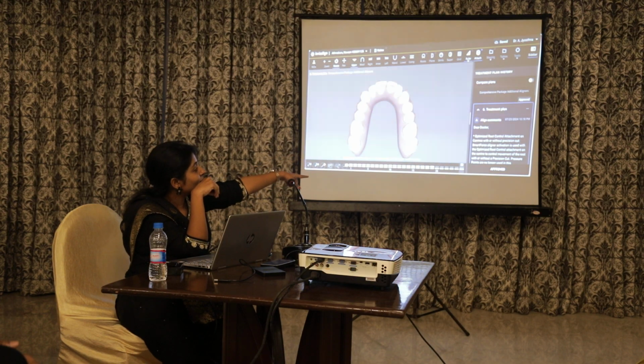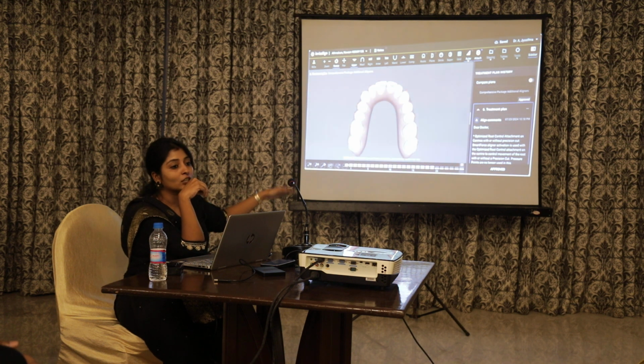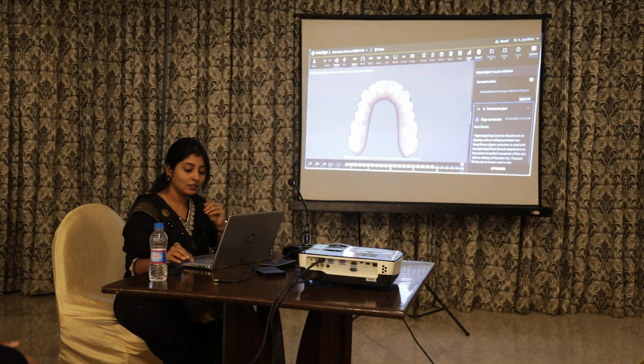So if we see the treatment plan history, those are the comments we need to write to the Align technician. We need to tell them that I want it to be like this, I want a little amount of intrusion. So they will correct according to your specifications and send it back to us.